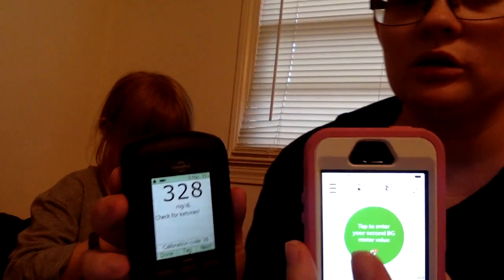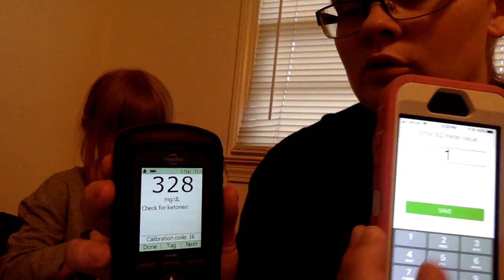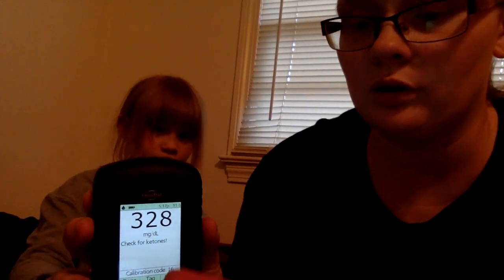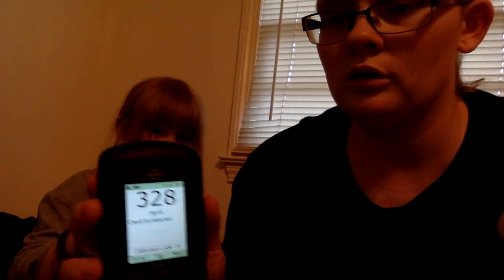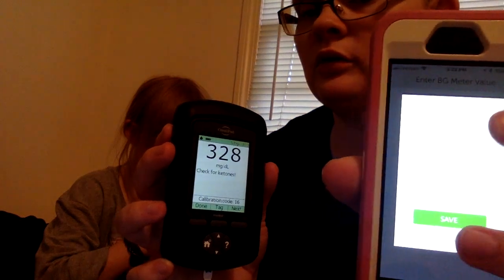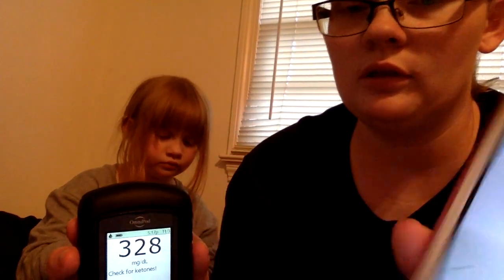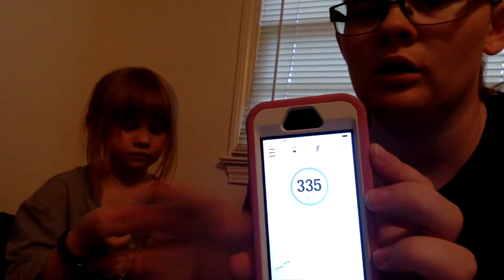So, we're going to come on here. Tap. That's not the right number. That's what I get for trying to do it backwards. 328. And it's saved. And there we go. We're calibrated.